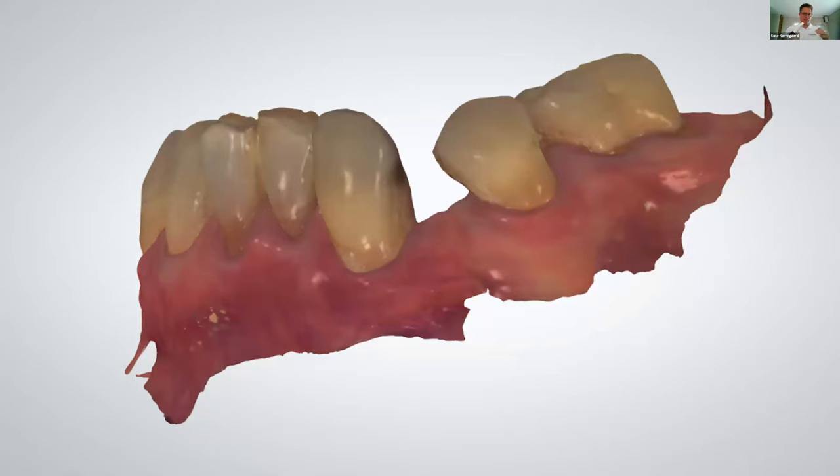So tilted teeth where you also have gaps can also be an issue, because the scanner is actually building upon a picture. So the first picture that the scanner takes inside the mouth is usually the occlusal surface of the big molar. And from that picture, it stitches on and builds up the whole scan. The good thing about that is that when we do that, then we can control the stitching and we can close the holes if there are any holes that are appearing during the scan, but we do get some challenges once we get to the large gaps.